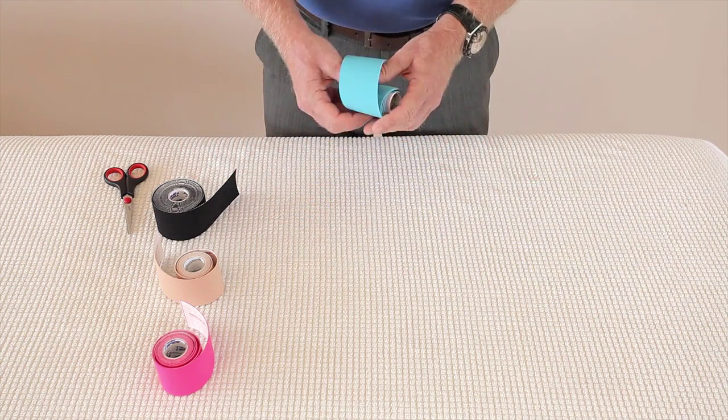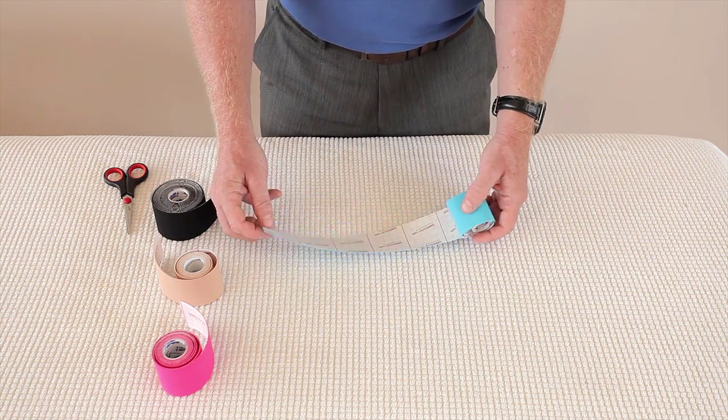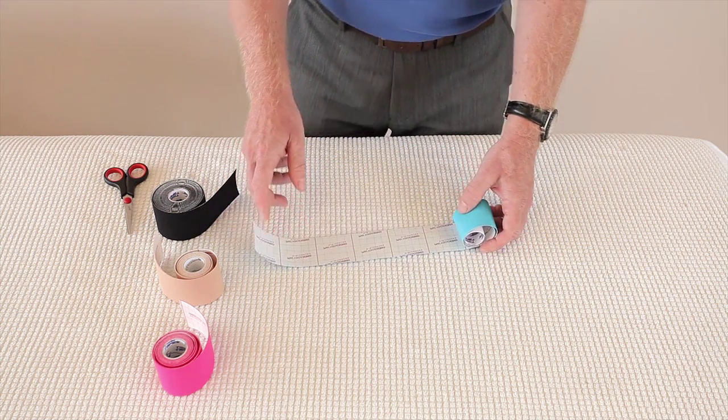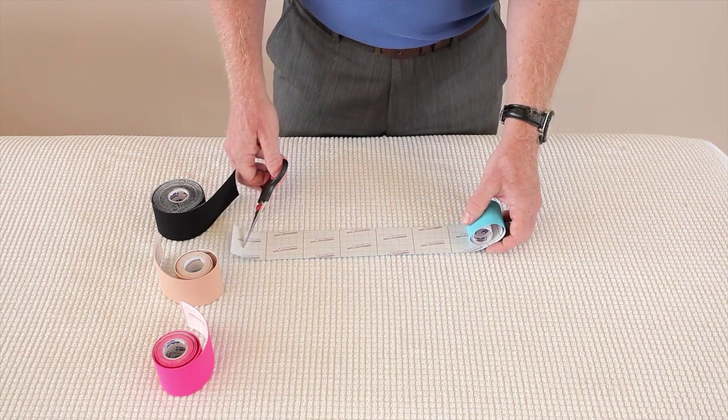If I show you a piece of kinesiology tape and turn it over, you'll notice it's got some squares. First of all, we're going to prepare what's known as an eye strip, and I'm going to use 6 squares.